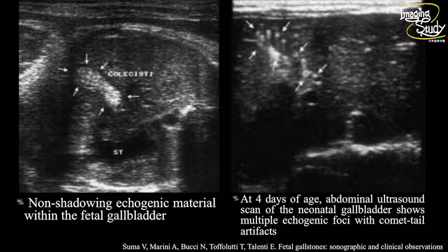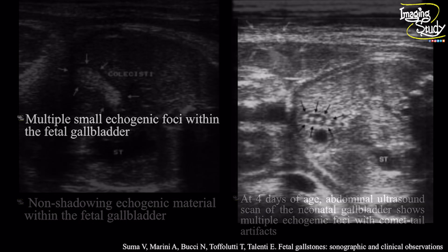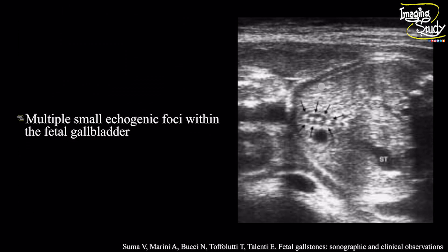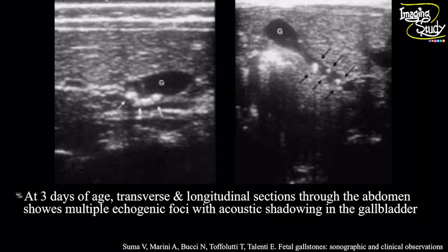These are tiny gallbladder calculi which may get resolved soon. In another case, you can see the hyper-echogenic foci noted at the fetal gallbladder. No posterior acoustic shadow is noted and these are gallbladder calculi. This patient got a follow-up scan at the postnatal period, and at three days of age the transverse and longitudinal section of the gallbladder by trans-abdominal ultrasound shows multiple echogenic foci casting faint posterior acoustic shadows, indicating cholelithiasis.